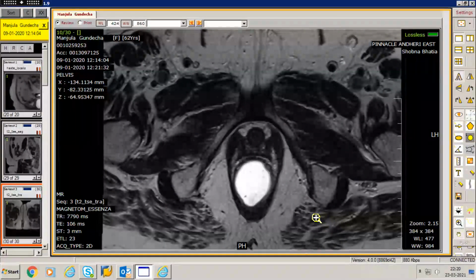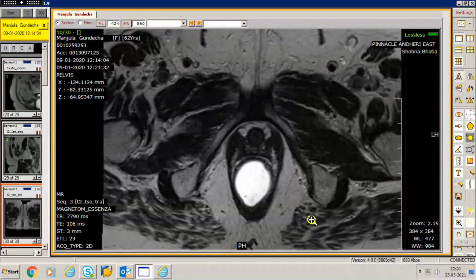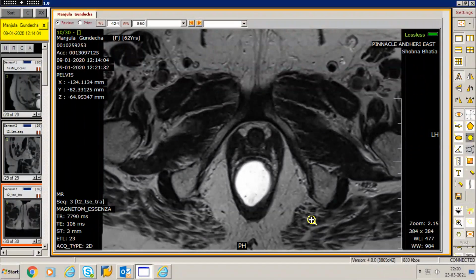So your anatomical images have to look at a lot of structures. You look at the fascia, then you look for the three types of endopelvic fascial injury. Then you look for the muscles. So you have the levator ani and its components, puborectalis, and then of course you have the perineal body and the urogenital diaphragm. These 4 structures, you've got to look for bulk, symmetry, signal intensity, disruption, discontinuity. All these points need to be looked at very carefully. Once you have finished the anatomical images completely, then only go ahead and do the defecography.